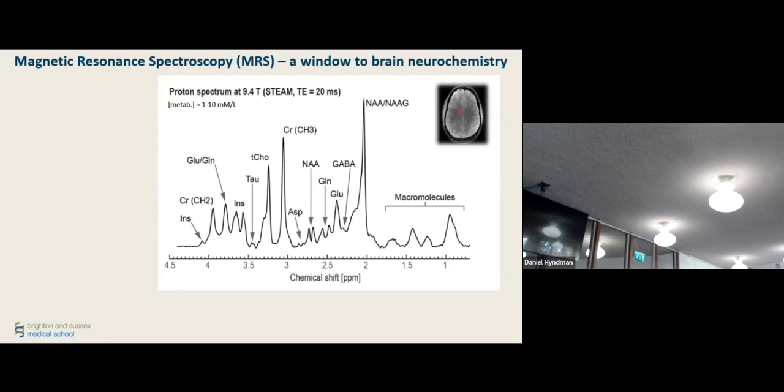But the beauty of those, and you see there are many different substances of which the peaks have been identified and associated with those molecules. And I'm not sure that all of those names mean everything to you, but those names are quite meaningful. So, for example, we do have metabolites that have hydrogen atoms that are characteristics of, let's say, neurons.